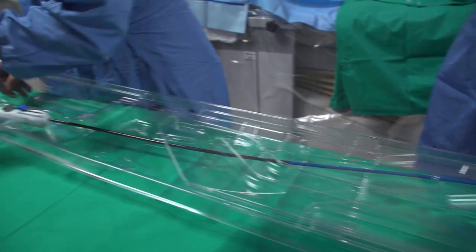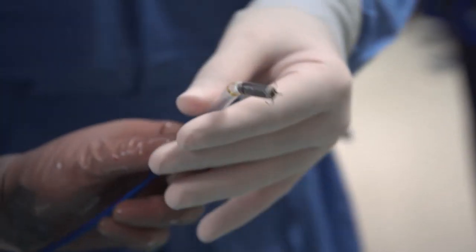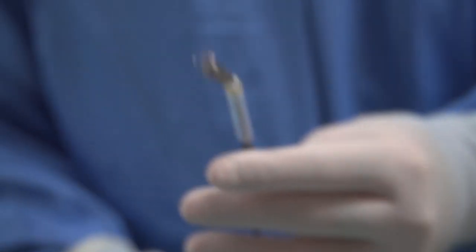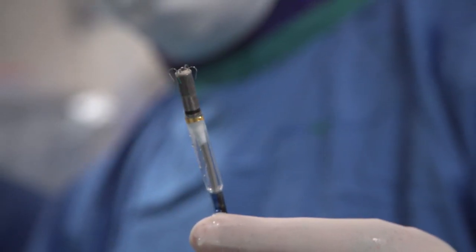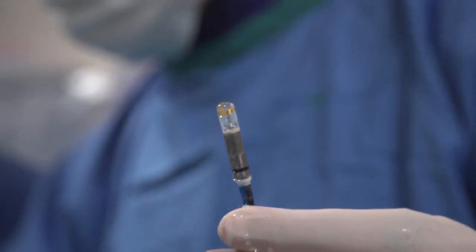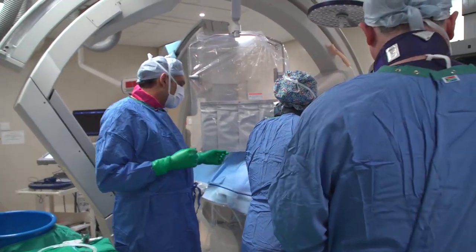We perform the procedure under conscious sedation. It's tolerated fairly well. It's not really an uncomfortable procedure at all. It is a fairly huge diameter sheath which we are introducing the pacemaker with, and so for that particular part of the procedure we ask for the anaesthetist to probably sedate the patient slightly more. So this is essentially the sheath which introduces the pacemaker into the heart.